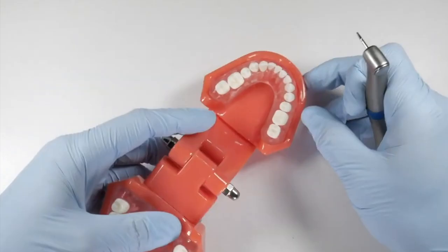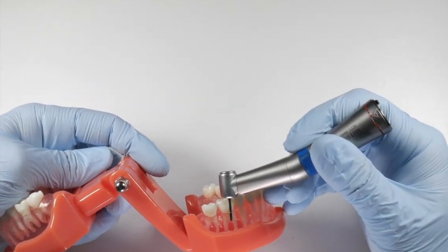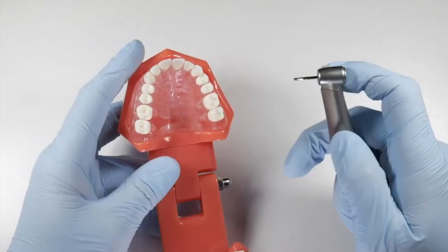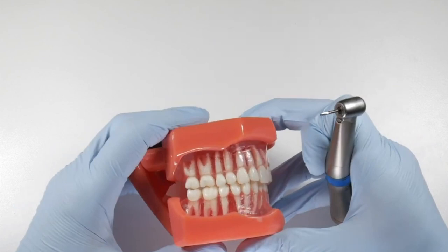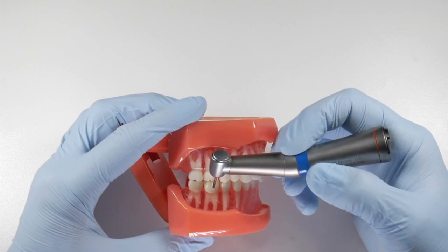On a lower molar, same thing. If you cut the crown off, you allow yourself better visualization of the root surface. Because these roots are offset from the occlusal surface, when you get rid of the occlusal surface you're more likely to section appropriately without tipping that bur at the wrong axis. Don't be shy to sink your bur way down in there. Make sure you're always clear of critical anatomy — the sinus and the IAN — but if you're nowhere near that, go very deeply to the point where you can see bleeding originating from the middle of your section. Give it a good rinse with saline as you section.